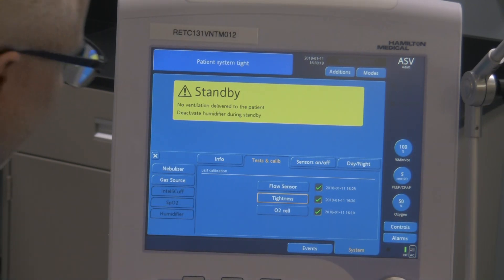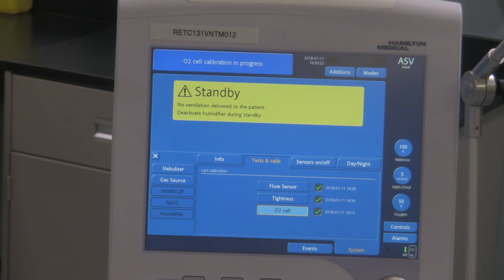Now I'm going to go with my fingers nice and carefully and hit the O2 cell one. Now it's calibrating the oxygen monitor — the fuel cell for the oxygen analyzer. Now, sometimes this can take a while, especially if the fuel cell is a bit older. So if it seems like it's taking a long time to calibrate, there's a good chance your fuel cell is getting used up and getting a bit old. You probably should look at changing that fuel cell eventually.